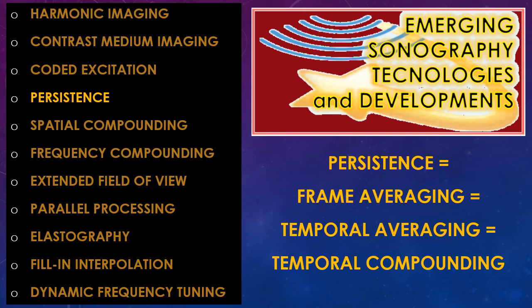Hello everyone, a new video on ultrasound physics, and today we'll talk about persistence. Persistence is also known as frame averaging, temporal averaging, and temporal compound.